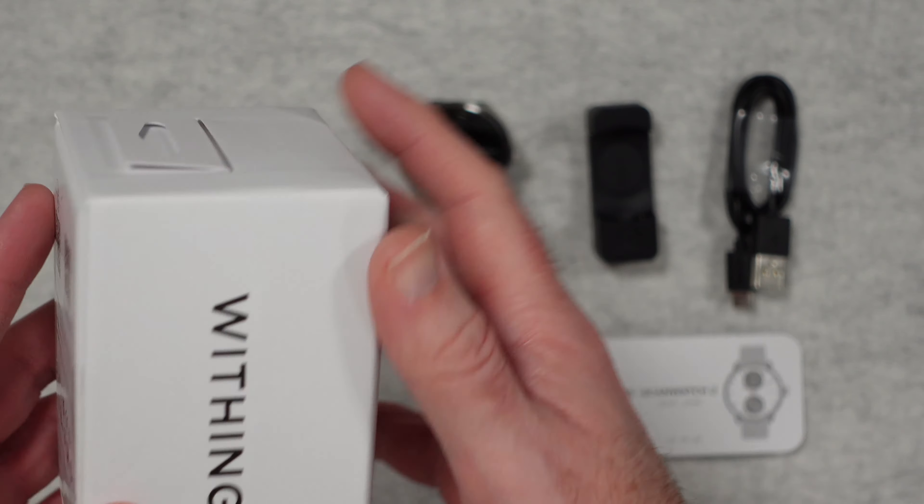And then we get the ScanWatch 2 itself. Before I put this on my wrist I just want to show you around the watch — it just looks like a normal high-quality watch. We've got a stainless steel case here with a combination of some brushed finishes and also some polished finishes as well. The satin polishing on the side is exceptional — it's really high quality.